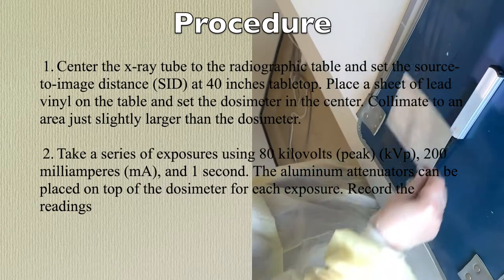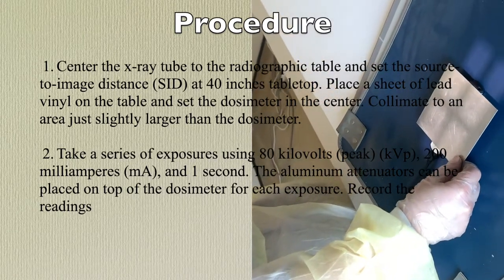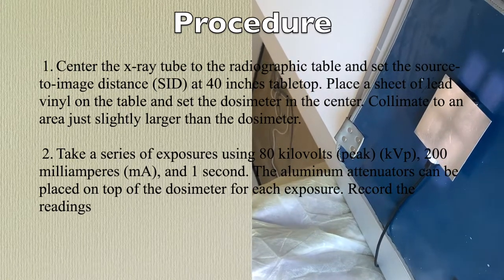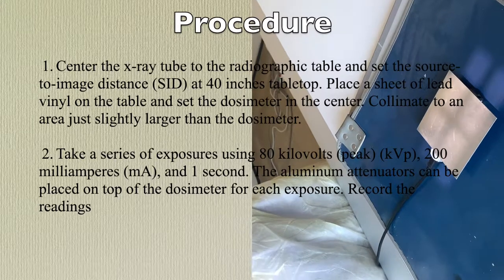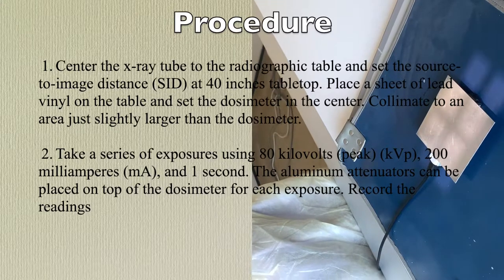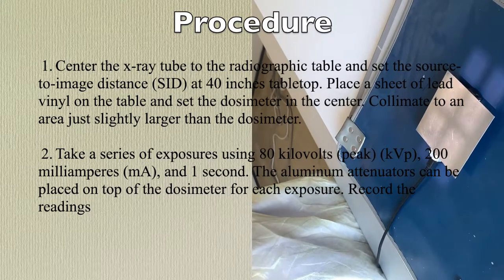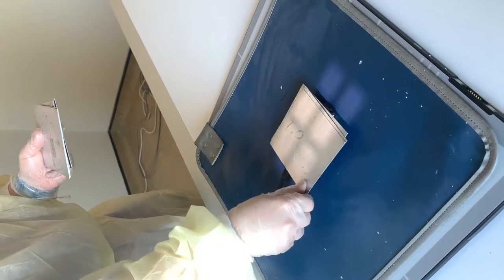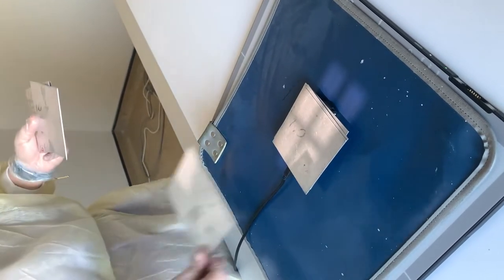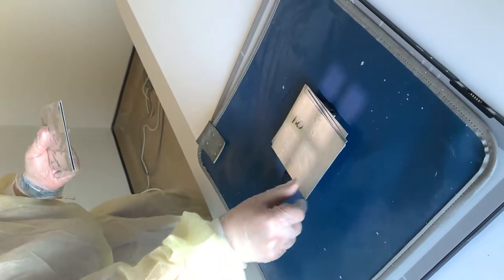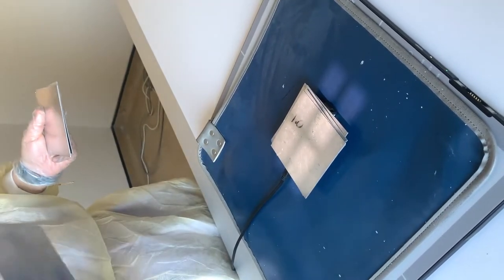After that, we add one aluminum sheet gradually, and then we expose, keeping the factors the same throughout the whole experiment. With each added aluminum sheet, we expose and check our values. We gradually add the sheets one by one after each exposure until we reach eight aluminum sheets, and with each sheet we add, we expose individually.